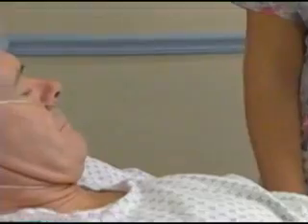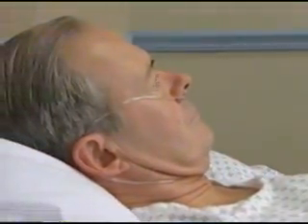But again, the home care company. If the patient is receiving IV fluids or medications at home, you must also teach him and his family how to maintain the infusion and change the administration.